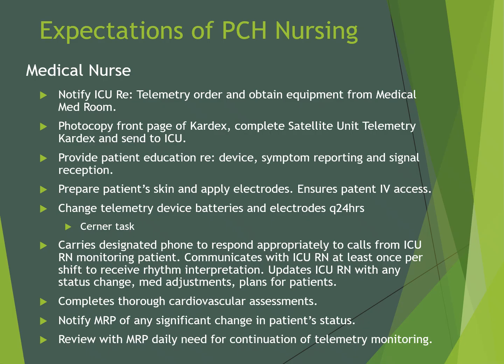The medical nurse will communicate with the ICU nurse at least once per shift to receive rhythm interpretation, and they will be responsible for updating the ICU RN with any status change, med adjustments, or plans for the patients. The medical nurse will complete thorough cardiovascular assessments and will be responsible for notifying the MRP of any significant change in the patient's status. The clinical lead or the primary medical nurse will also review with the MRP daily the need for continuation of telemetry monitoring.